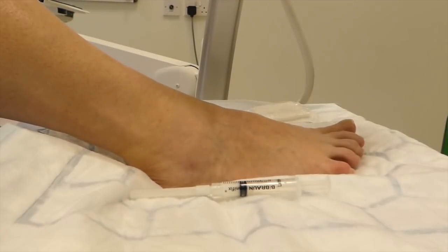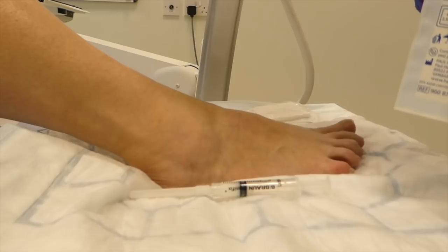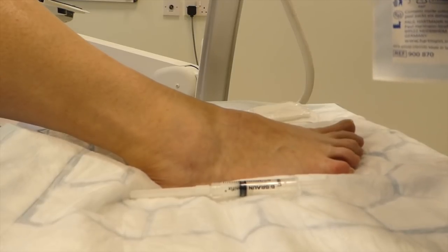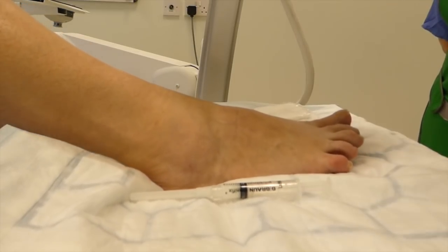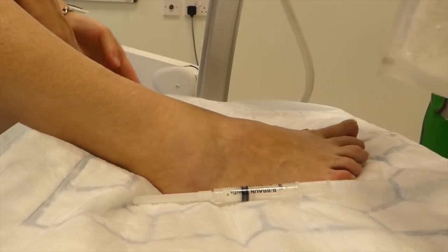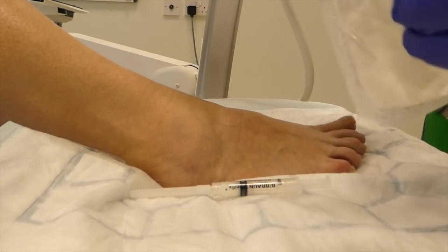Put some gloves on — don't need to be sterile for these. Get a plaster ready, just some Cosmopore. We checked before that the patient was not allergic to adhesives. You're not allergic to Mepic surely? The patient confirms she is allergic to all adhesives. So we're going to send this patient home without a dressing — there'll be a small trail of blood leaving theatre, but it's okay.